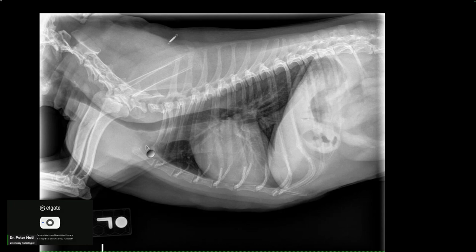And then you go, oh, it's coughing because of the trachea. But no, it's just an indirect indicator that you need to look further upstream. So I think dorsal tracheal opacification, and then you go, you know what, this is a large breed dog, it could be laryngeal paralysis if that fits, it could be the esophagus dumping in which case it's no big deal. Sometimes the membrane will just invaginate a little bit, and that's normal as well.